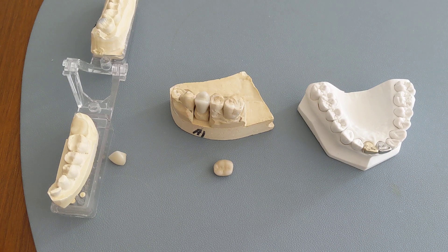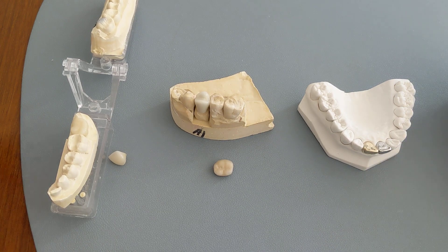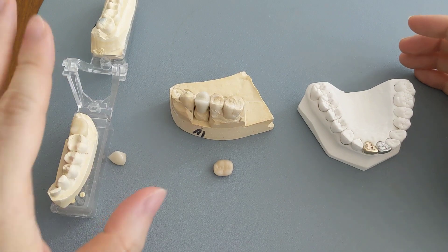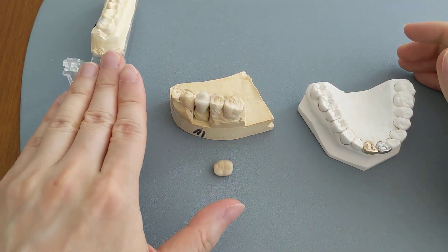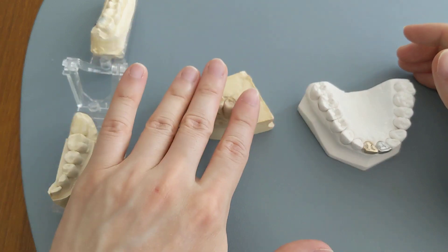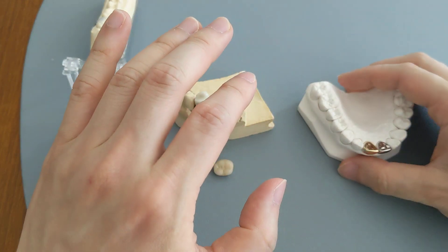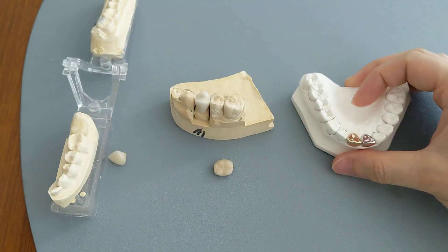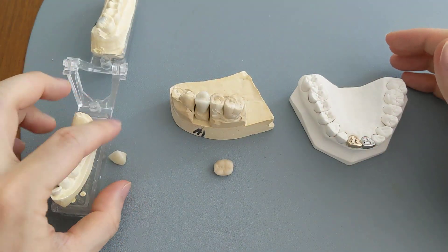This video is just to show you the differences in how different types of crown material look like. Here we have four different types of crown material: the all ceramic one which is all porcelain with no metal, the porcelain fused to metal crowns, one gold one, and one all metal one. Let's look at each of them individually.